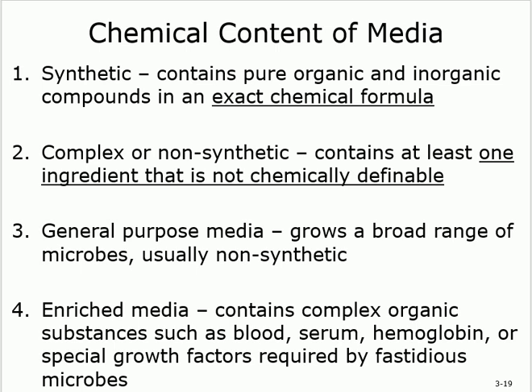Okay? The second one, which is not synthetic, so you don't have much say on it, we call it complex. And this is the one that contains at least one ingredient that you don't know what it is. It's not chemically definable. Is that clear? If you know every single detail, you made it, and you know all the exact numbers. And also, add to that, and we will see it, reproducible. So I can make 100 of those, I can make 1,000 of those. All of them are copies of each other.